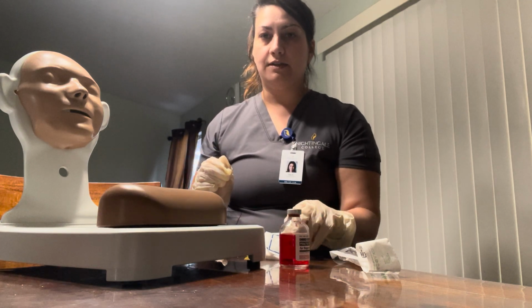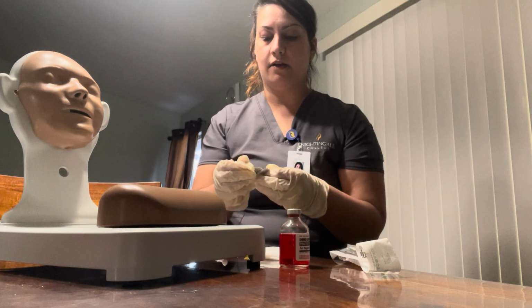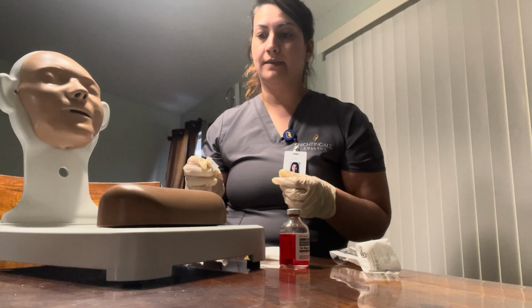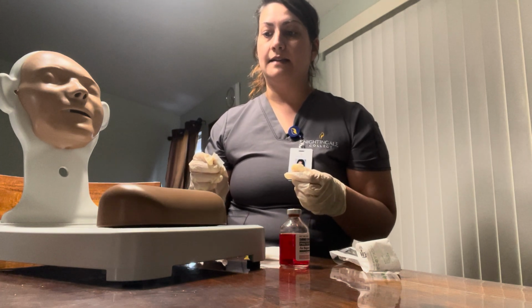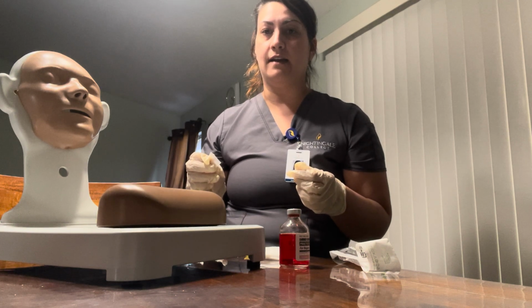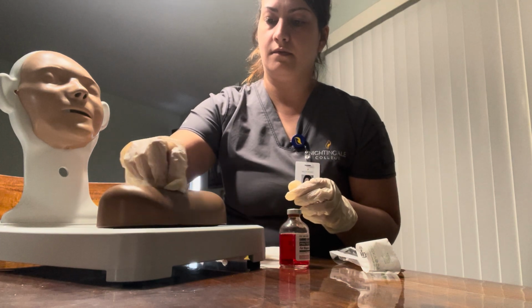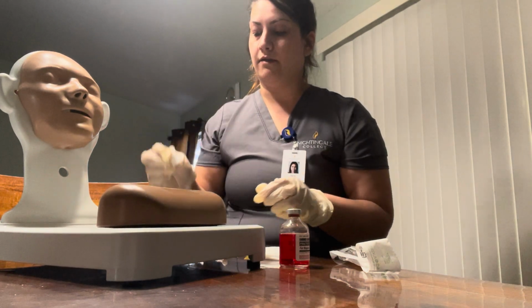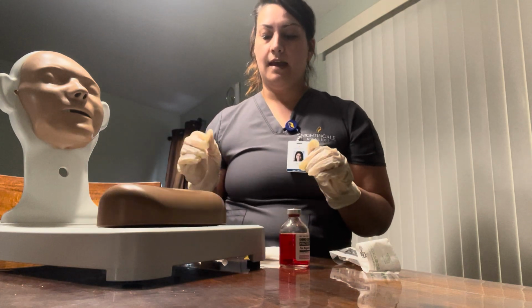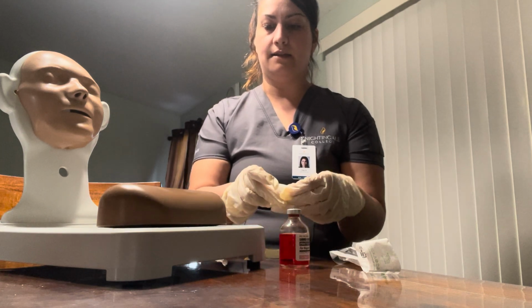Next, I'm going to take my alcohol wipe, and we are going to clean the area, starting at 5 centimeters, 2 inches out. There we go. We discard this and we let it dry. We do not touch it. Next, we are going to get ready to inject.